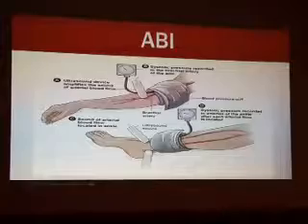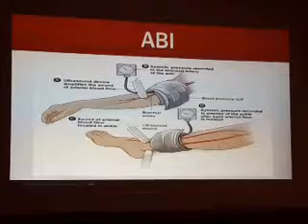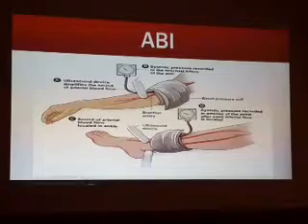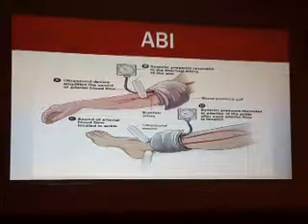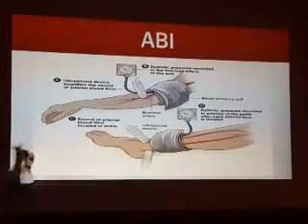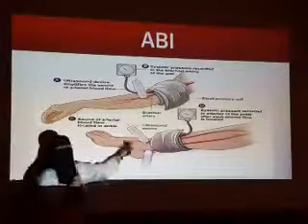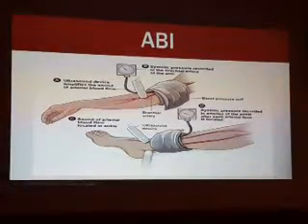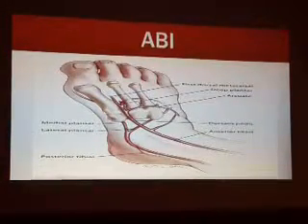For what? To avoid misdiagnosis. If the patient already has high blood pressure and you start to measure the ABI, this will give you a wrong value, not because of the disease, but because the patient already has high blood pressure. So we take the blood pressure from the brachial artery in the arm and we compare with what? The ABI compares the brachial pressure and the ankle. In the ankle we have 2 arteries, 2 districts, not one. What are they? The dorsalis pedis and the posterior tibial artery.